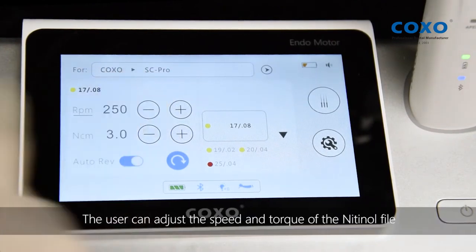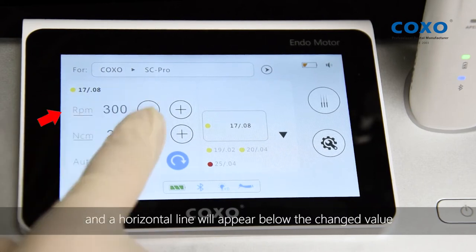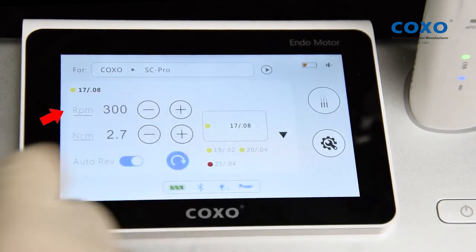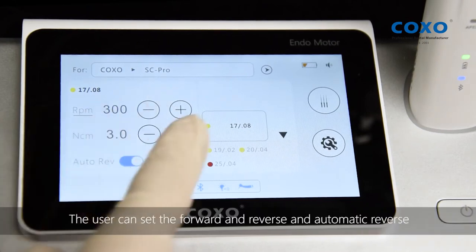The user can adjust the speed and torque of the Nitinol file, and a horizontal line will appear below the changed value. The user can also set the forward and reverse and automatic reverse.